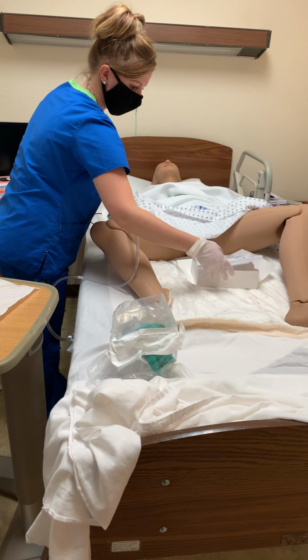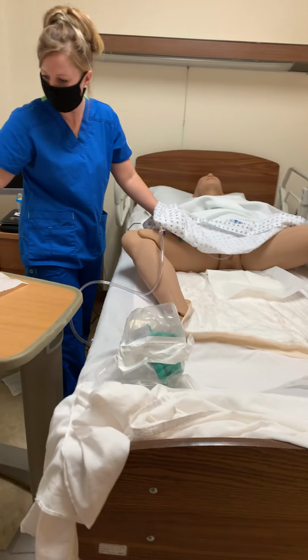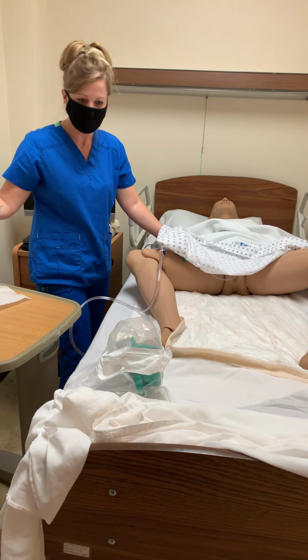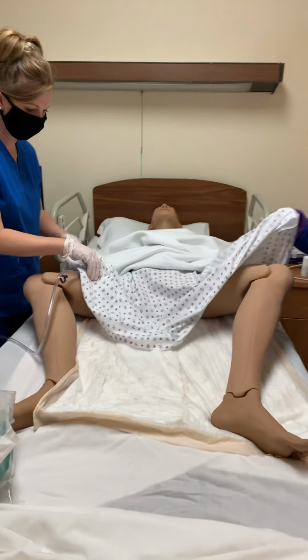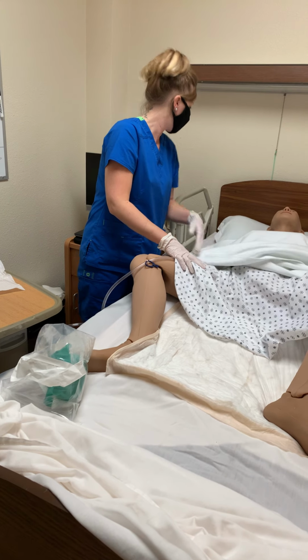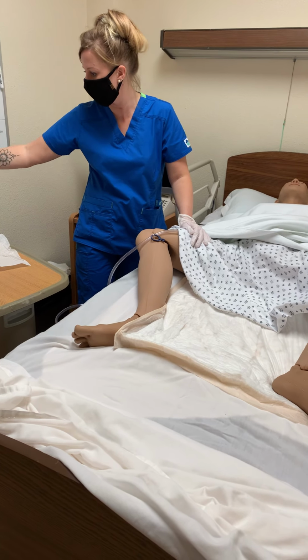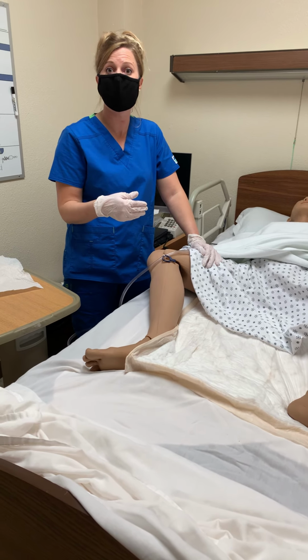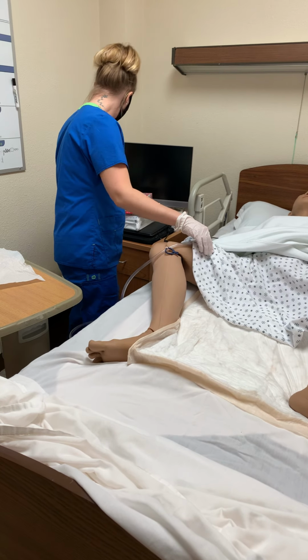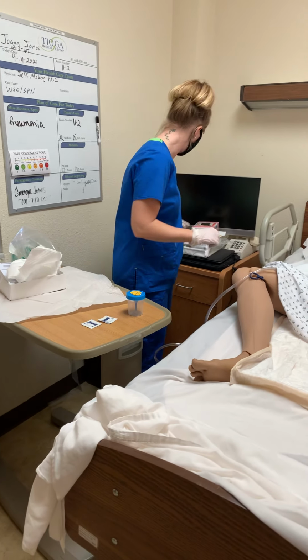Just going to move all of this for now. I would label when we put the catheter on and who did it. So it's strapped to the leg, it's at the end of the bed. I am able to put Joanne's head up. For video purposes though, we are going to take the catheter out, and before that we are going to get a urine specimen. So as we have the urine specimen, I'm going to take my cup here.